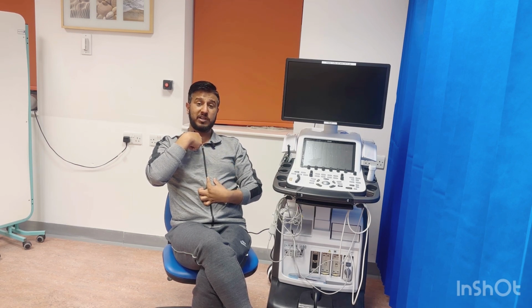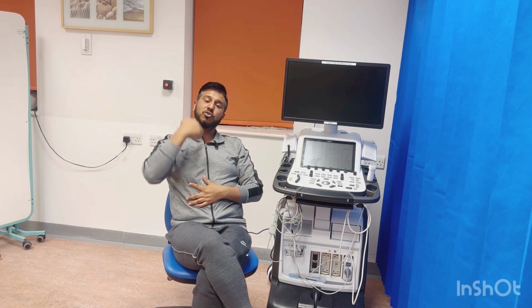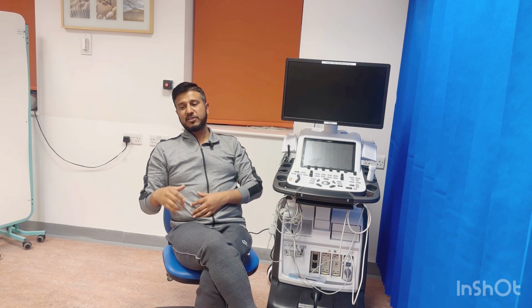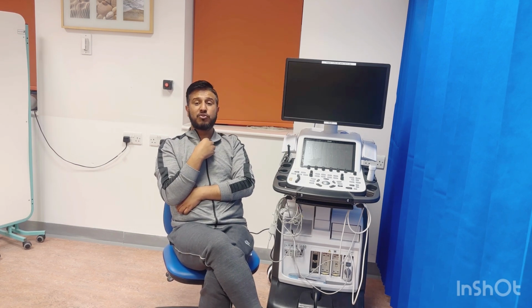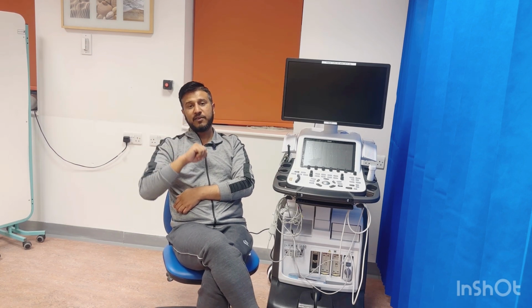So the systolic flow will be blue, and then after the systolic flow you will see a red flame coming towards you, towards your probe. That is actually the flow reversal. Some people put the color there in M-mode and try to get that one. That is also a very good way to do it, but you can put the Doppler in and get the reversal.